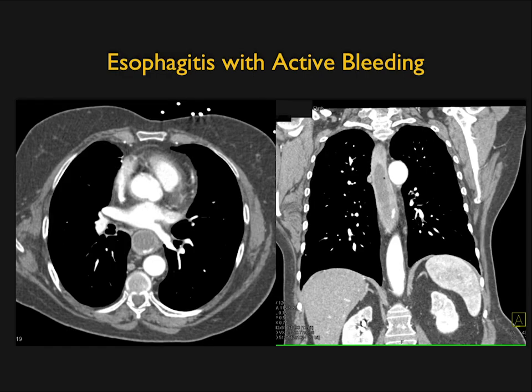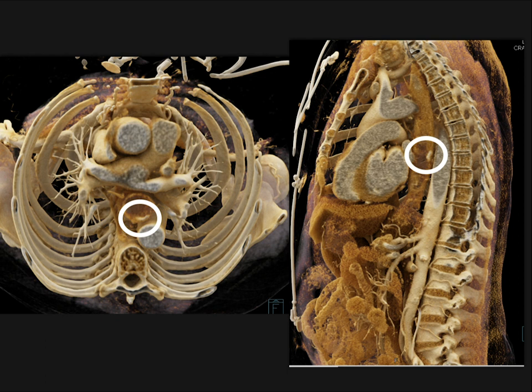This patient had GI bleeding and we weren't sure from where. Look at the esophagus — it's dilated, and on the left posterior wall there are bright structures indicating the active site of bleeding. On the posterior gastric wall, cinematic rendering nicely shows this active bleed in the mid-esophagus.